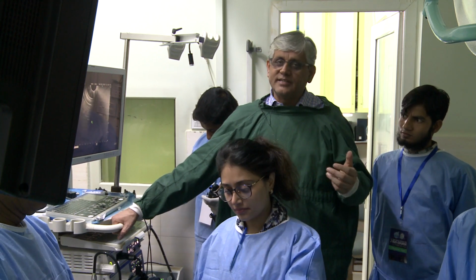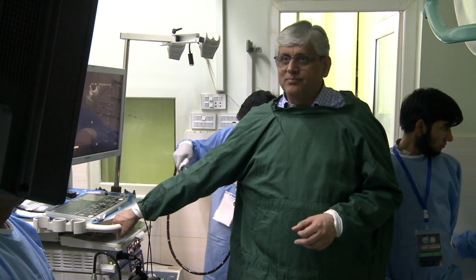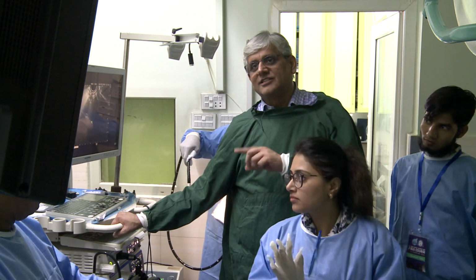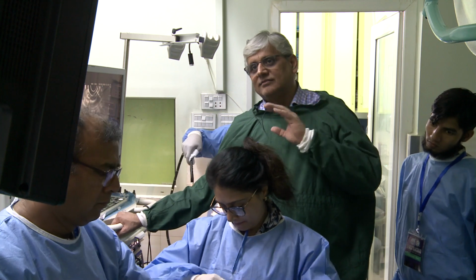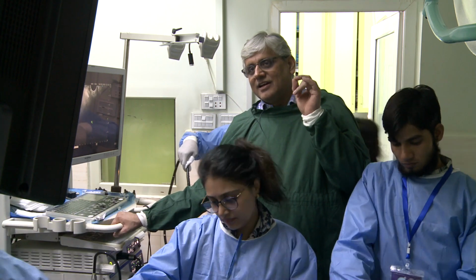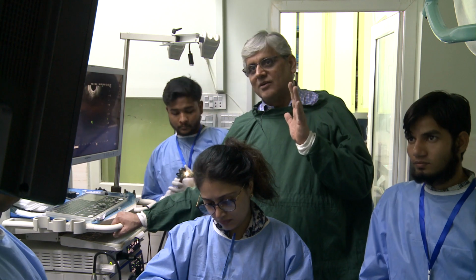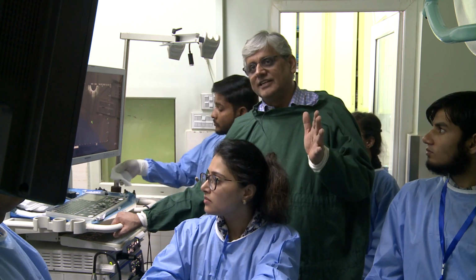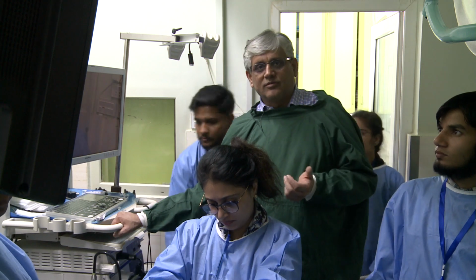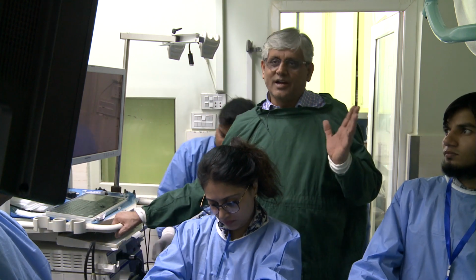Air we saw, so there is patency, thrombosis at the distal end of the CBD, hypoechoic, ill-defined area seen in the head of the pancreas, distal end of the CBD, FNB done, good adequate samples obtained, pancreatic duct, question mark, seen in the head, lots of calcification and features of chronic pancreatitis seen, no tail and body of the pancreas seen, and then portal vein appeared thrombosed, small lymph node seen in the subcarina looked inflammatory, review with biopsy. That's what I would generally report.